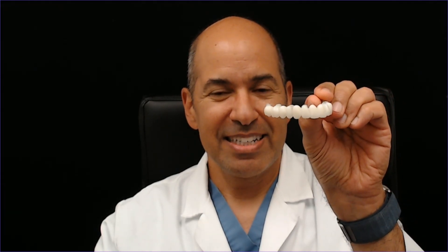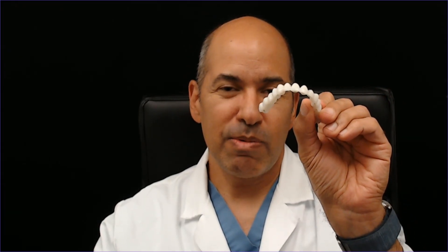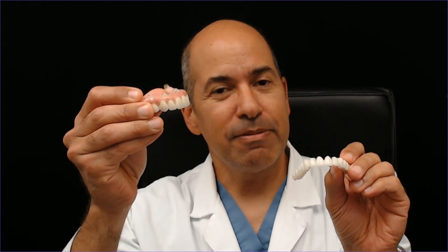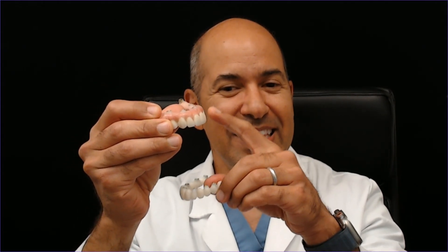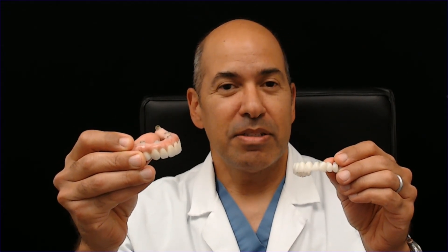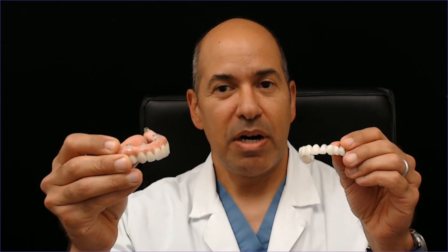In our mind, everybody would like to have a bridge like this. It's smooth, it's sleek. We refer to this as crown and bridge or FP1 — FP1 is the term for it. The other extreme is called FP3, which has teeth, gums, and replaces bone as well.